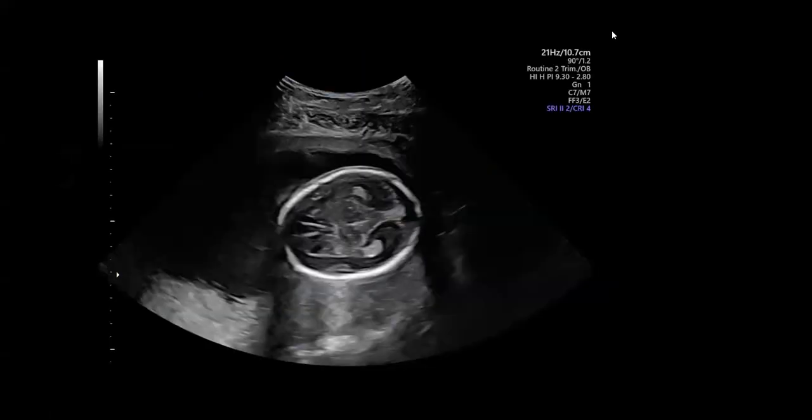Okay, so this is the first image that you see once you place that probe on top of the maternal belly. So how can we actually improve this image? But before we move forward, let's go ahead and just take note of this frame rate that you could see right up here. And it's usually placed on your upper right-hand corner.